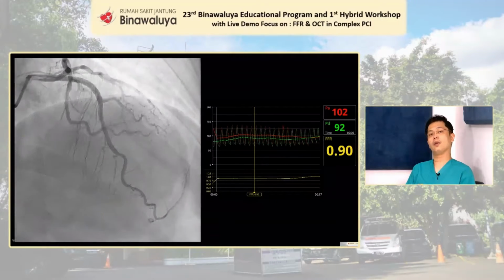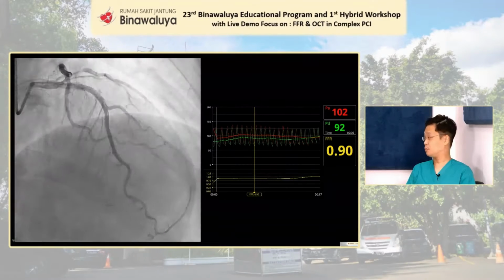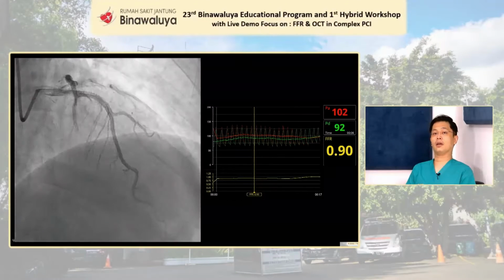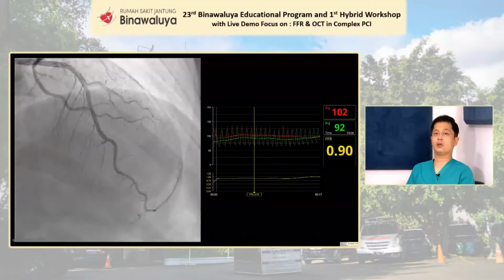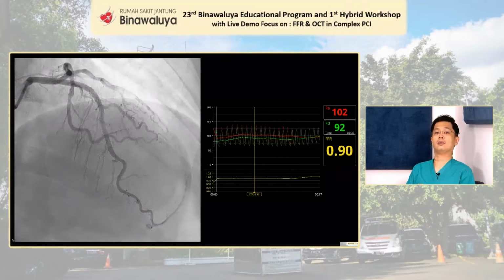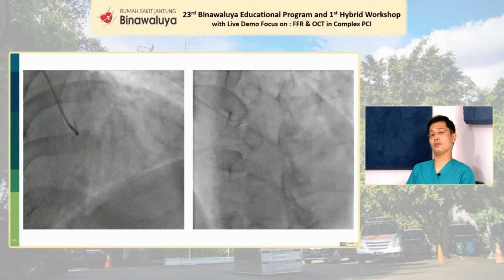Now, the reason I wish to highlight this case is that I wish to introduce a concept of post-PCI FFR, which I think is very important that everybody should assess, and the physiological assessment should not actually stop at the pre-PCI level. As you will see in the next case, the post-PCI FFR can be an extremely valuable assessment towards optimization of PCI.